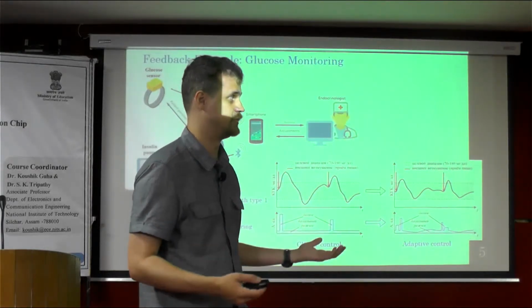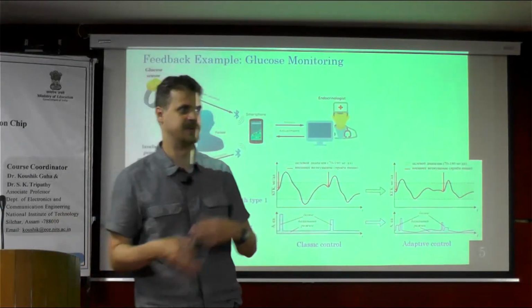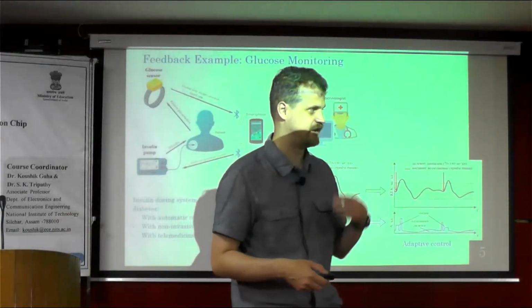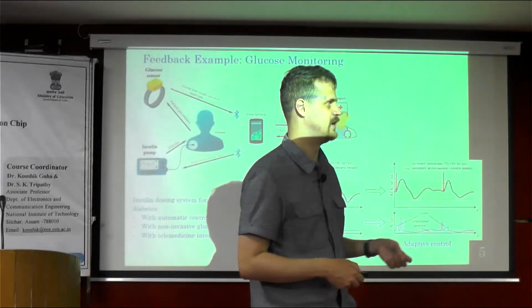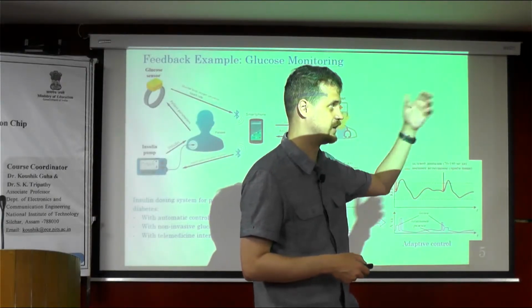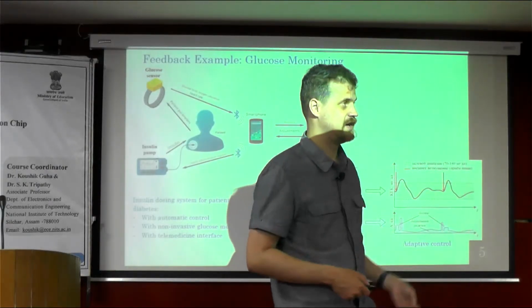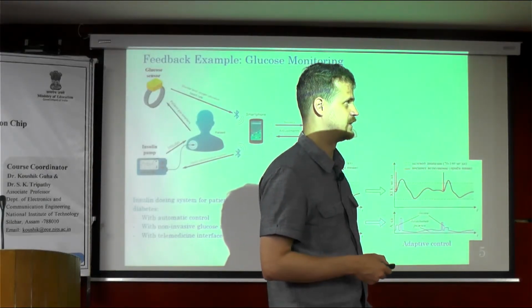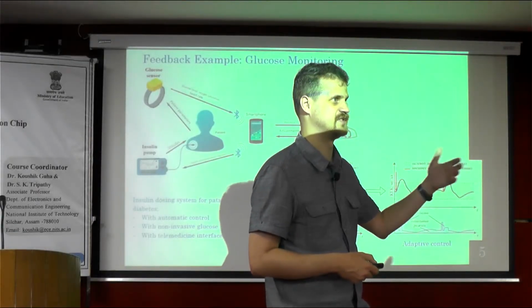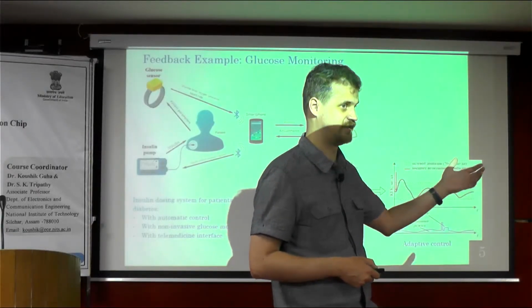So if we want to combine the optical method with the enzymatic method, we need to take into consideration that the enzyme has to be very long-term stable and work for years. Usually it's not the case. If we exhaust the concentration of the enzyme, that means that the glucose sensor will not be working the way it's intended to work.